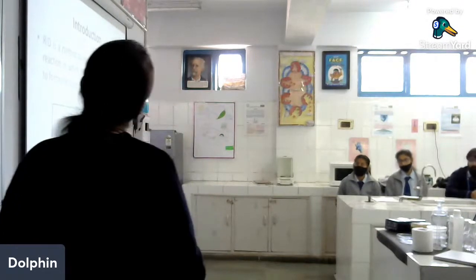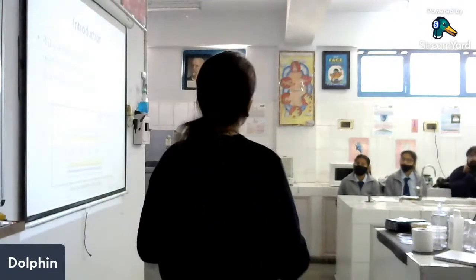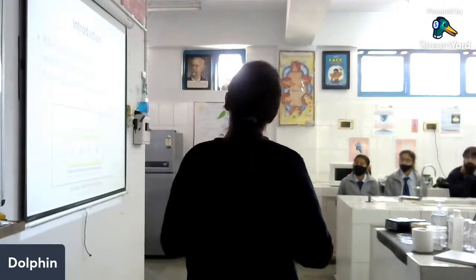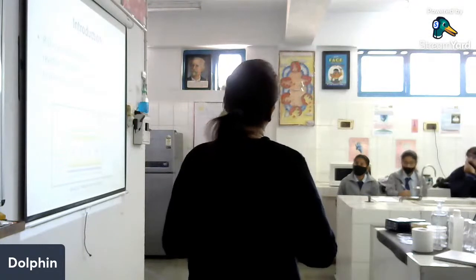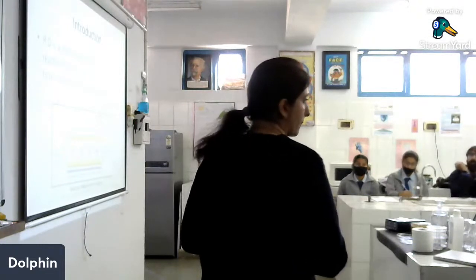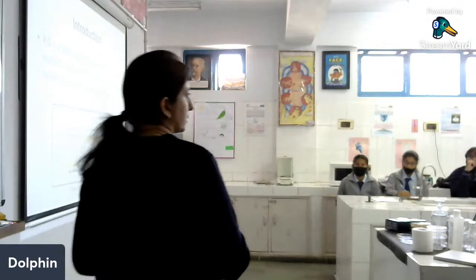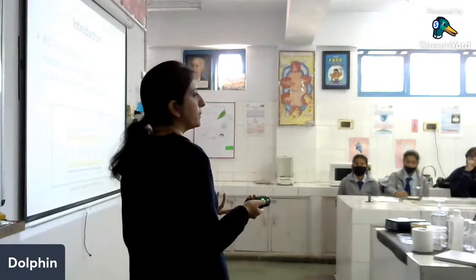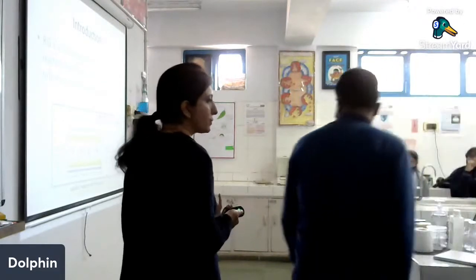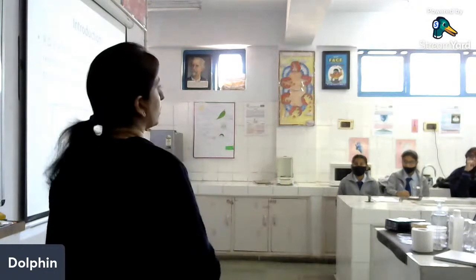So radial immunodiffusion, these are conventional methods. This is a classic precipitation reaction where antigens and antibodies react to give us a precipitin ring in the semi-solid medium. Is it both qualitative and quantitative? This is quantitative, qualitative also. If you don't get a ring, that means the antigen and antibodies are not specific. But there are other reasons also why you cannot get a ring.